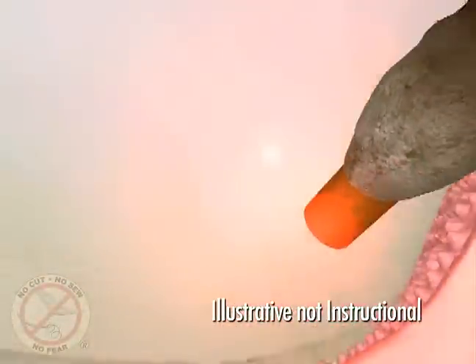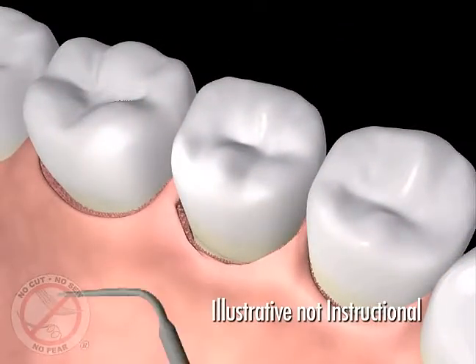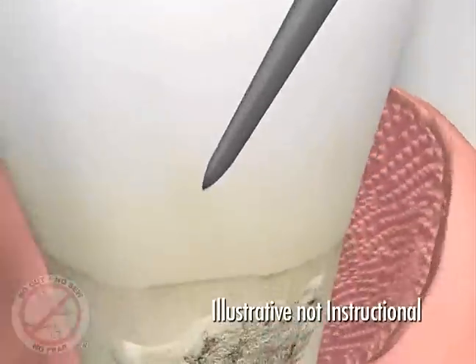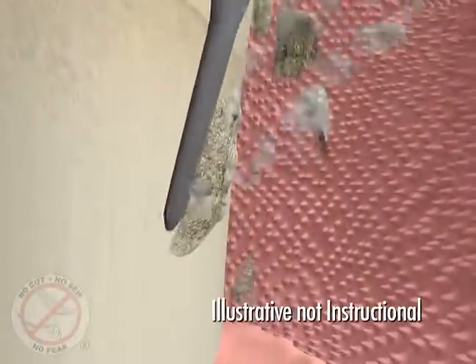This also improves access and visibility for better removal of the barnacles of calculus from the surface of the teeth. Tiny ultrasonic root cleaners vibrate these deposits away and flush them out with antibacterial rinse.